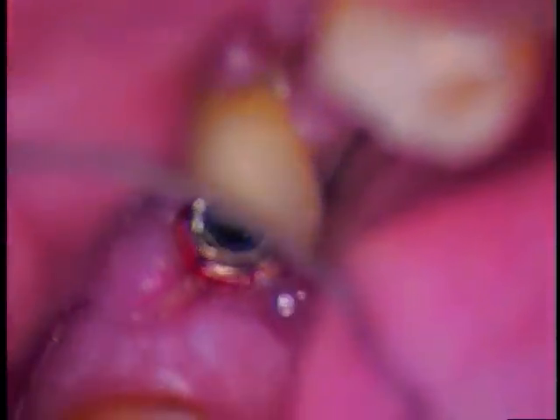So perhaps they were grabbing part of the fixture when they were turning and trying to remove the upper portion. I could pre-soak this a little bit — you know what, I'm going to do that. I'm going to pre-soak it. I think maybe it would be best. I'm just going to ask my patient something, so why don't I click out of this and we'll come back on the next segment.